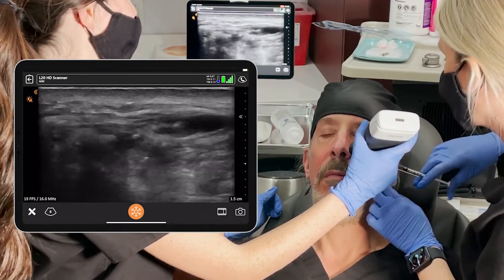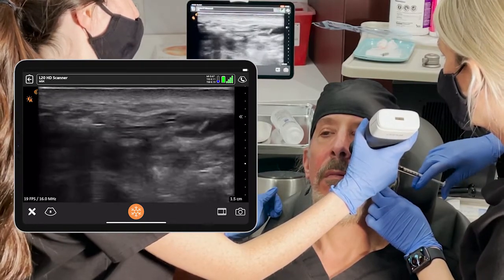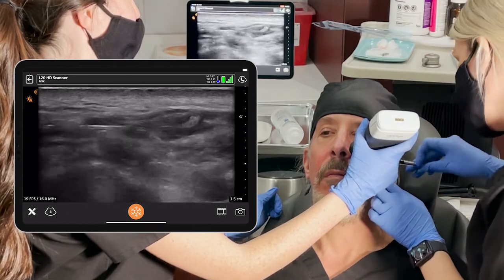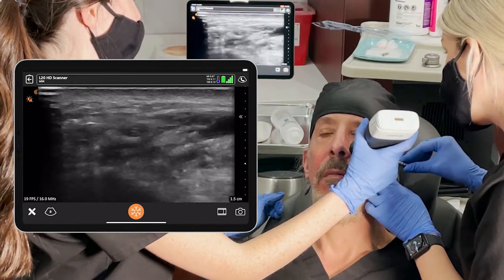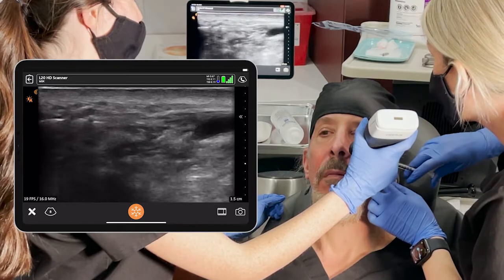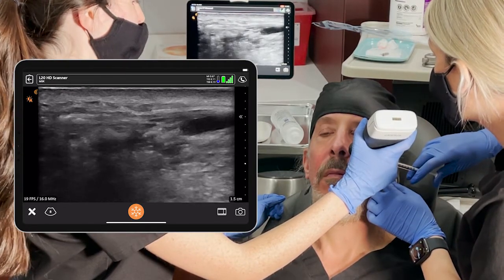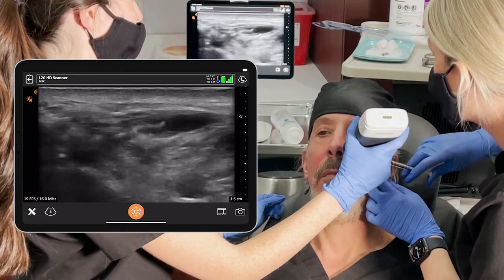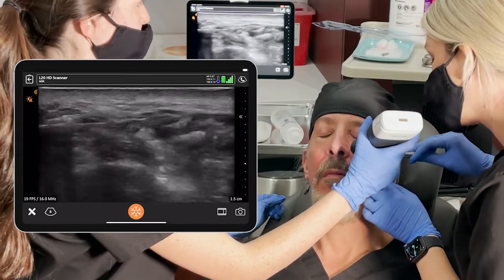There's another one. This doesn't need to be a two-person procedure — you could do this by yourself, one hand on the probe, one hand on the needle. You can do it. If you have an assistant, it's probably a little easier, but you can do it. You're holding it, trying not to move, and looking up at the screen. I learned from my radiology colleagues that when they're doing procedures, they use an assistant too.